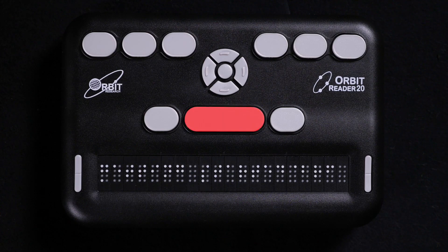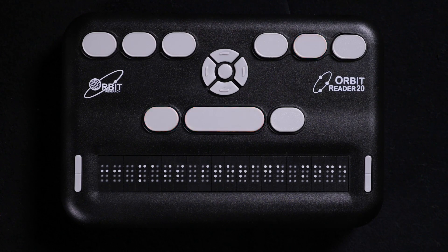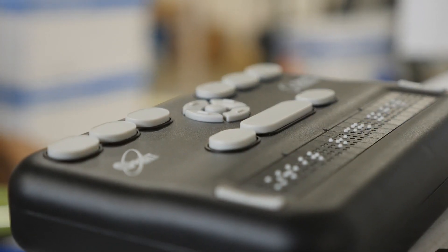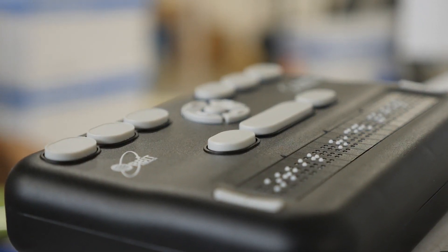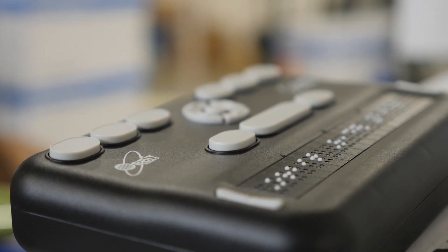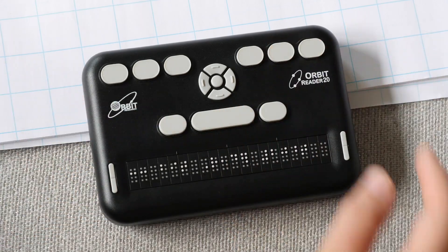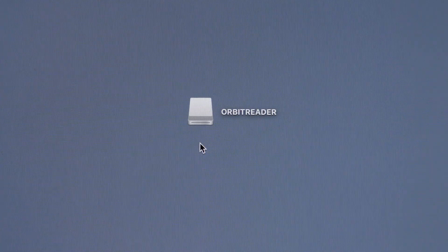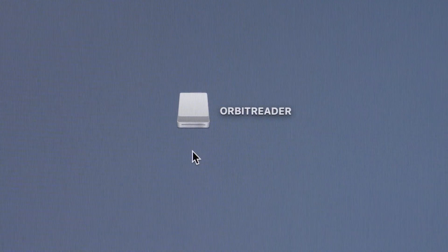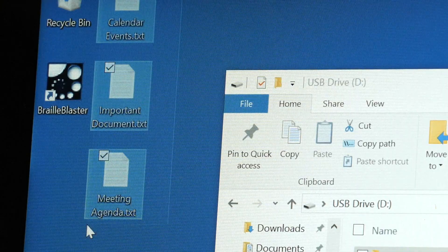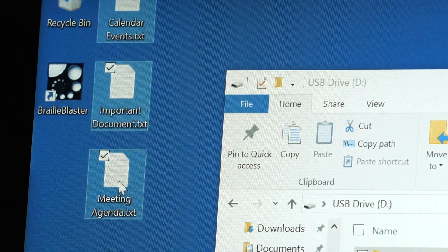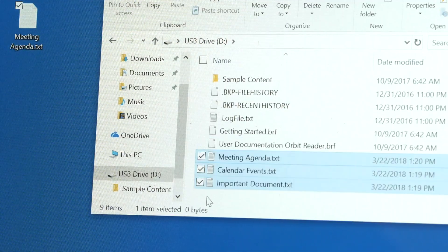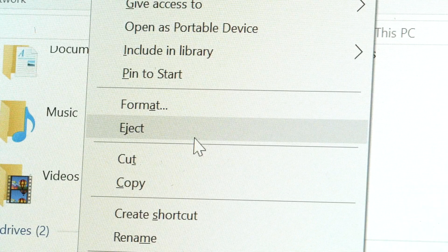After plugging it in, press Space plus dots 5-7, or you can select mass storage from the USB option in the menu. When connected to your computer and using the mass storage protocol, your Orbit Reader will show up as an external drive which you can copy files onto. Just note that you won't be able to do anything else with it until you eject or unmount it.